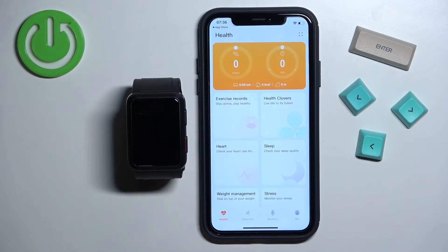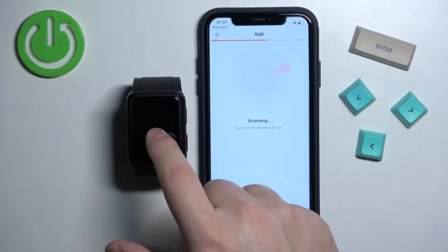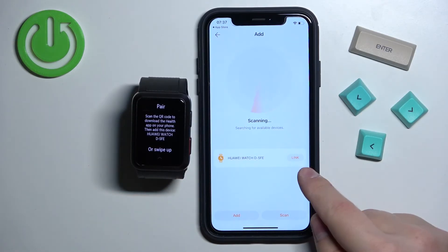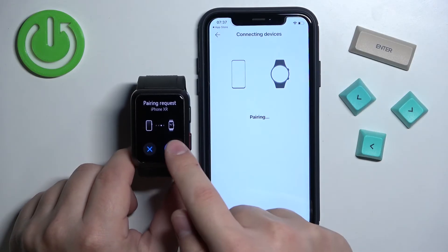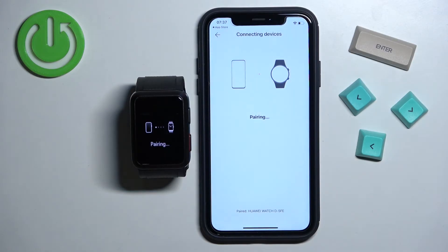Once you're done with the health permissions you should see the health page in the app. Now tap on Devices, then tap on Add. The app will start scanning for nearby devices and after a couple of seconds it should detect your Huawei Watch D. Here we have it — tap on Link, then confirm the pairing on the watch by tapping the check mark, and then tap Pair on your iPhone.